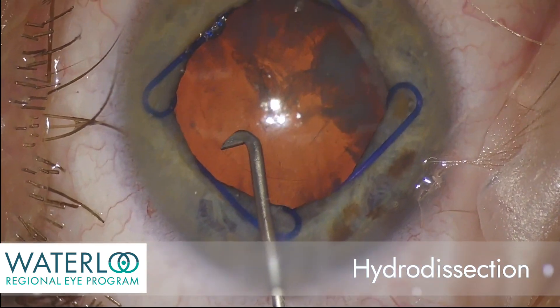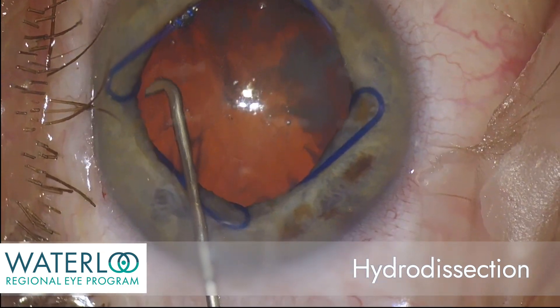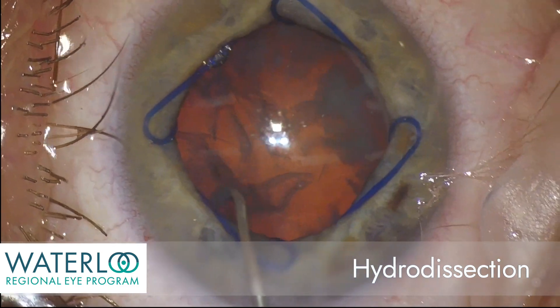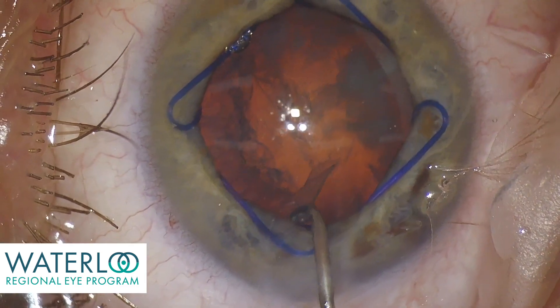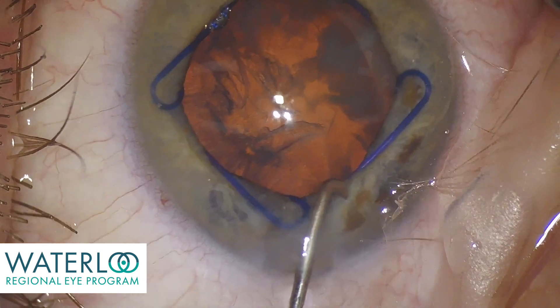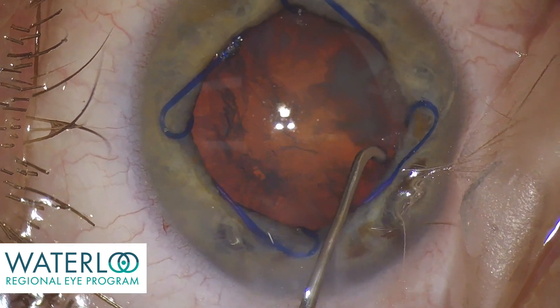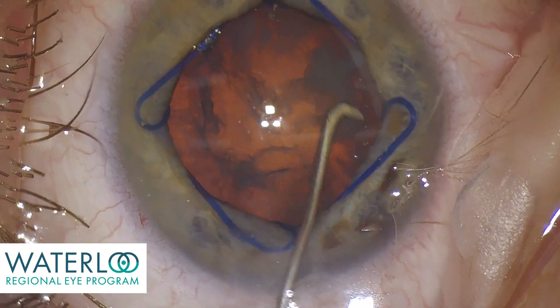In hydrodissection, specialized fluid is used to irrigate between the capsule and the cataract, separating them and allowing the cataract to rotate so that it can eventually be broken up into fragments. Here a Chang cannula is used, which allows for sub-incisional hydrodissection.